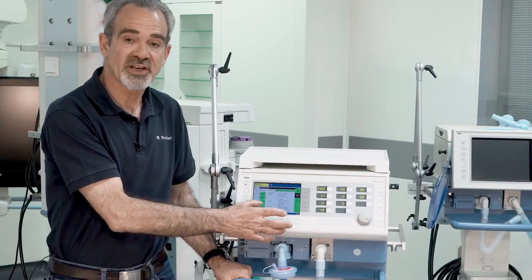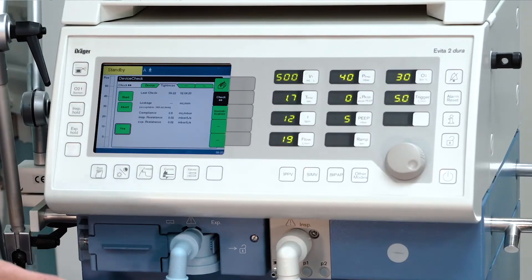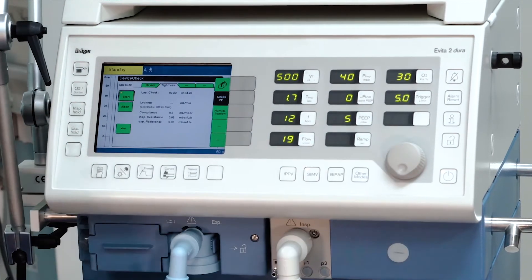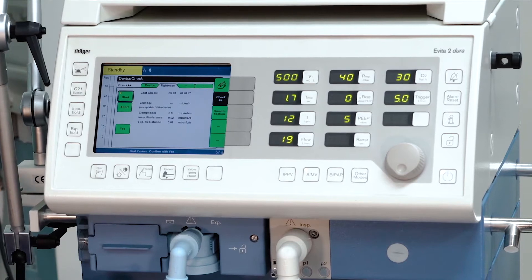After the device check is completed, start the tightness check by selecting start and confirm, and follow again the instructions on the bottom of the screen.